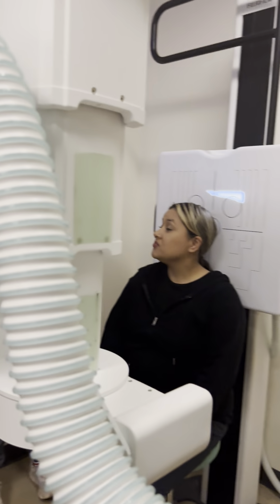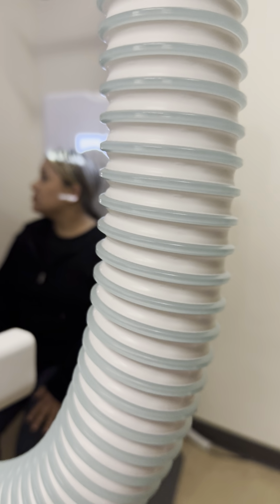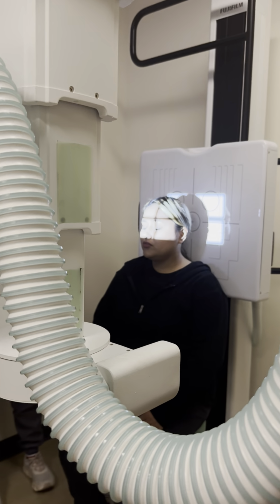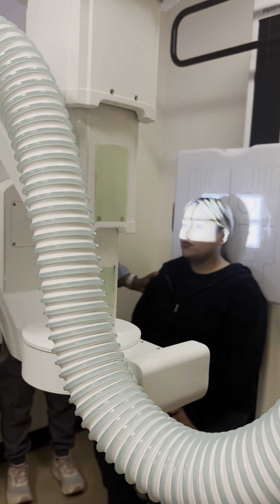Well, I was doing it, I kept looking, I was like, why is the 15 degree angulation off of it? It's supposed to be down instead of up. Yeah, they have a reverse Caldwell, which is up, but then a regular Caldwell. It should still be a Caldwell from the AP projection.